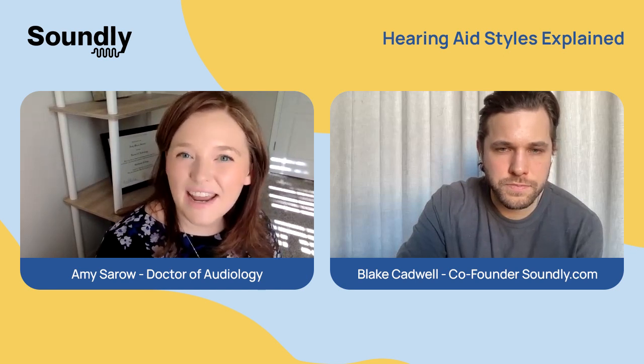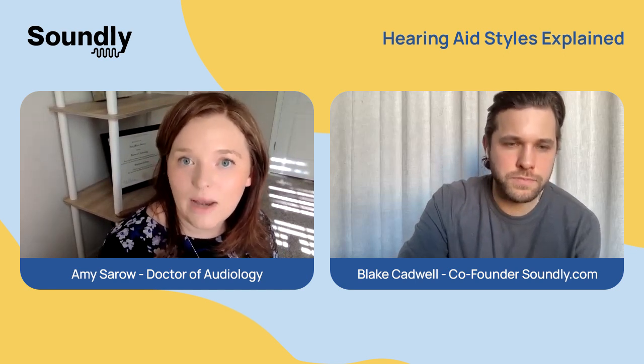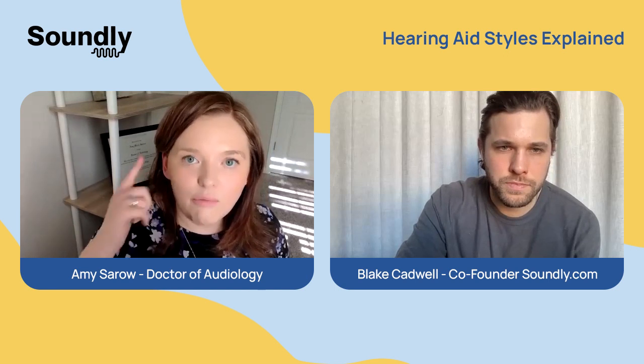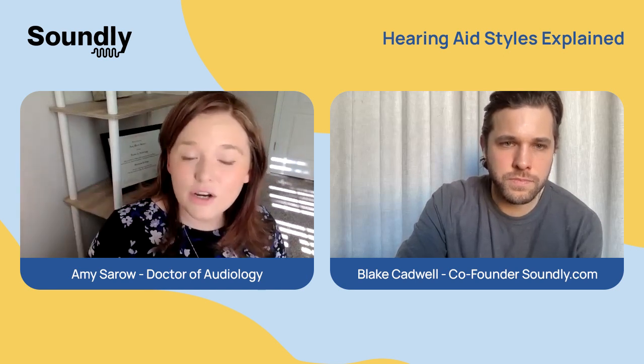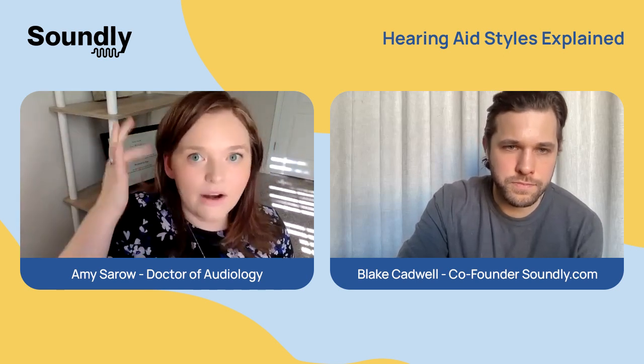Typically, it's going to be able to connect via Bluetooth to your phone, to an app. You'll probably have push buttons or a wheel on there if you need to adjust something, if you prefer to do it manually. For people who have dexterity concerns, manipulating a larger piece out of the ear is sometimes easier than maneuvering that piece behind the ear and then the piece in the ear canal there. So that is the ITE. Then we have an ITC, which is a little bit smaller here.